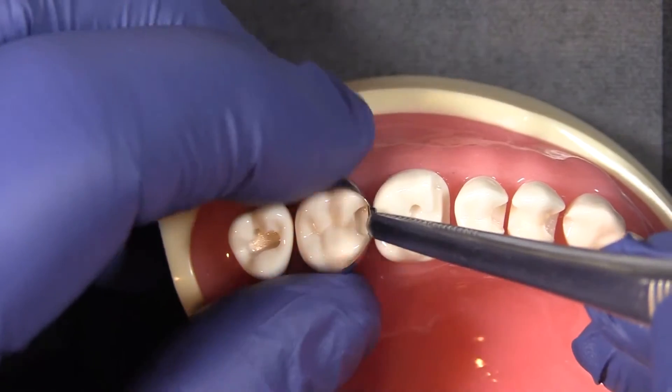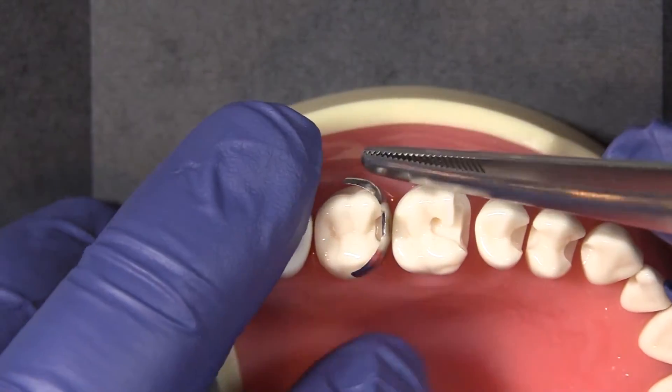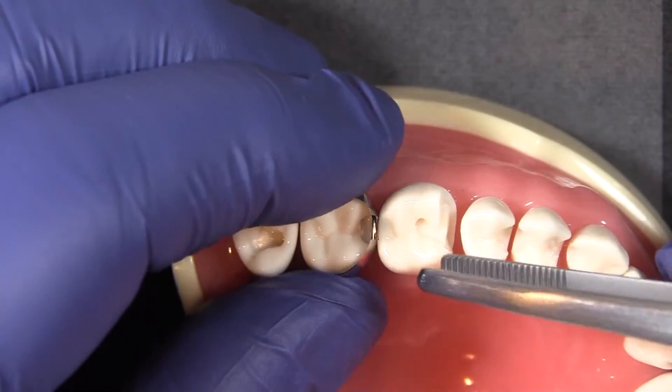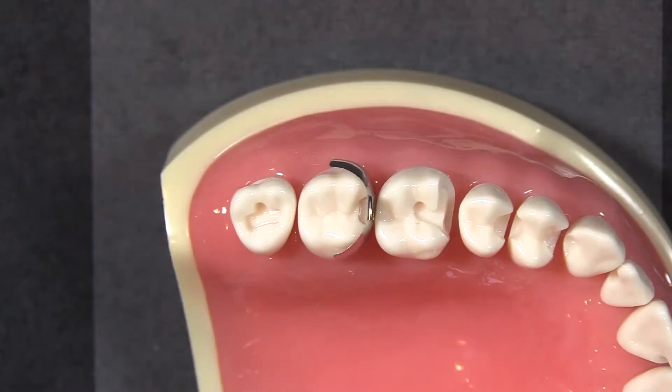Make sure that you get the band seated down as far gingivally as possible — you can even take the ends of the band and tuck those down into the sulcus a little bit. I'm going to grab an orange wedge for this restoration.